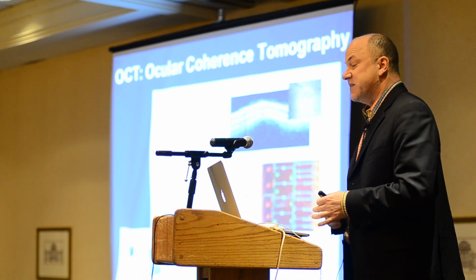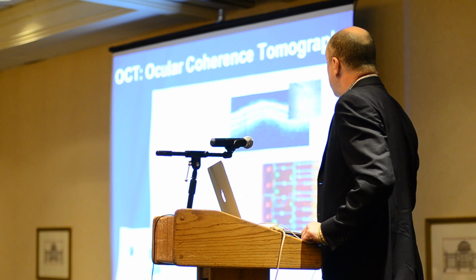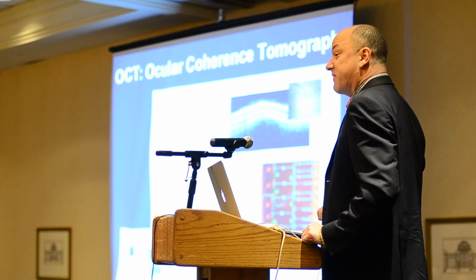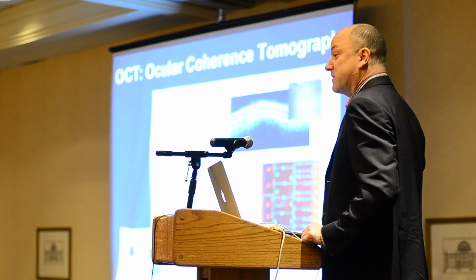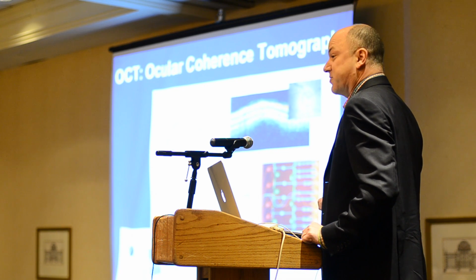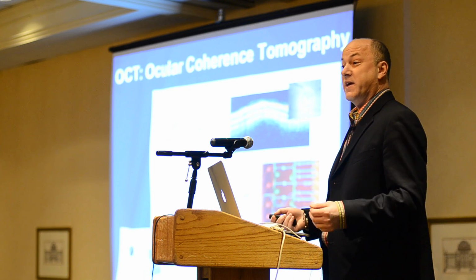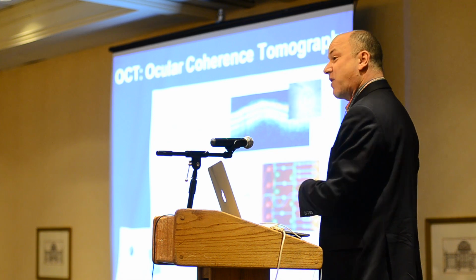So how does OCT work? Well, basically, a near-infrared light source is shined through a beam-splitting mirror, bounces off the back of your retina, is compared with a comparator light source going off another mirror in the other direction, and the differences in the coherence of the light forms are then deconvolved into an image of the surface of your eye.